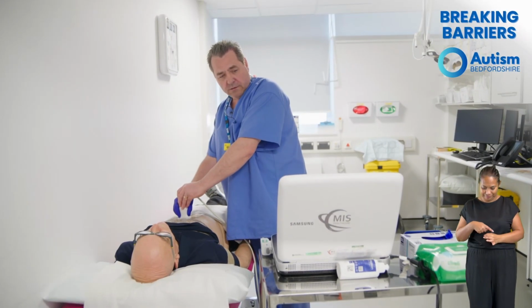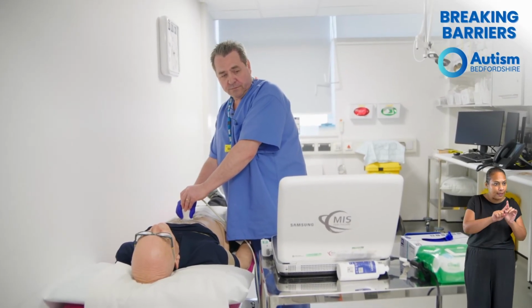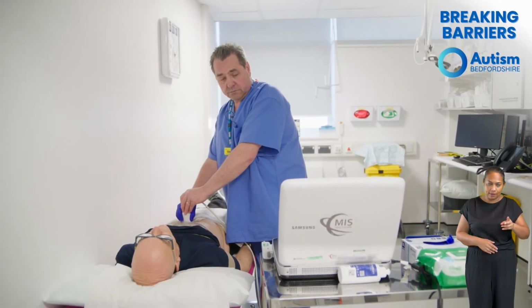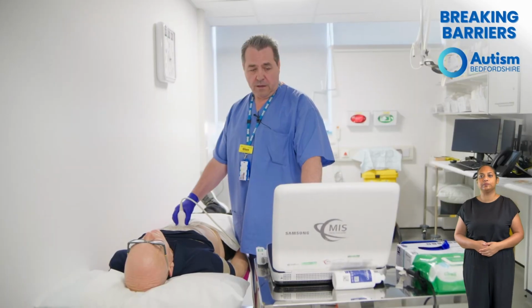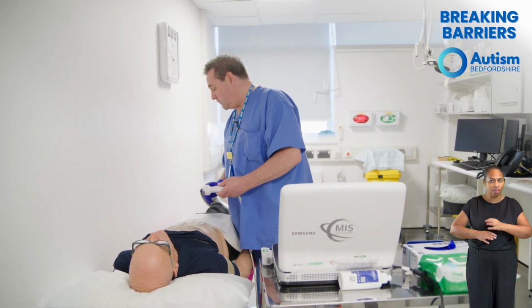And the last image I'm going to take is a cross-section view of your aorta, which I will take an image and measure that for you as well. Everything looks absolutely fine. There don't seem to be any problems with an aneurysm there.